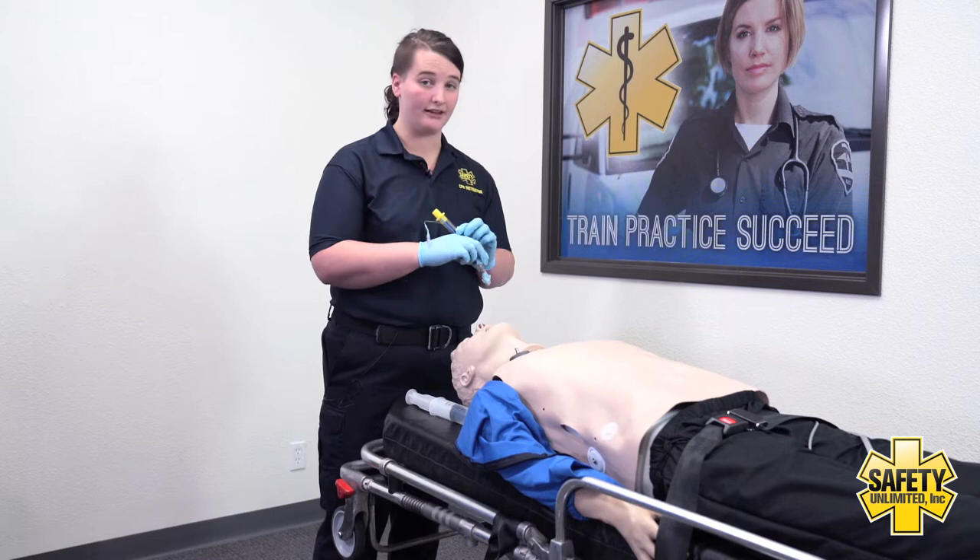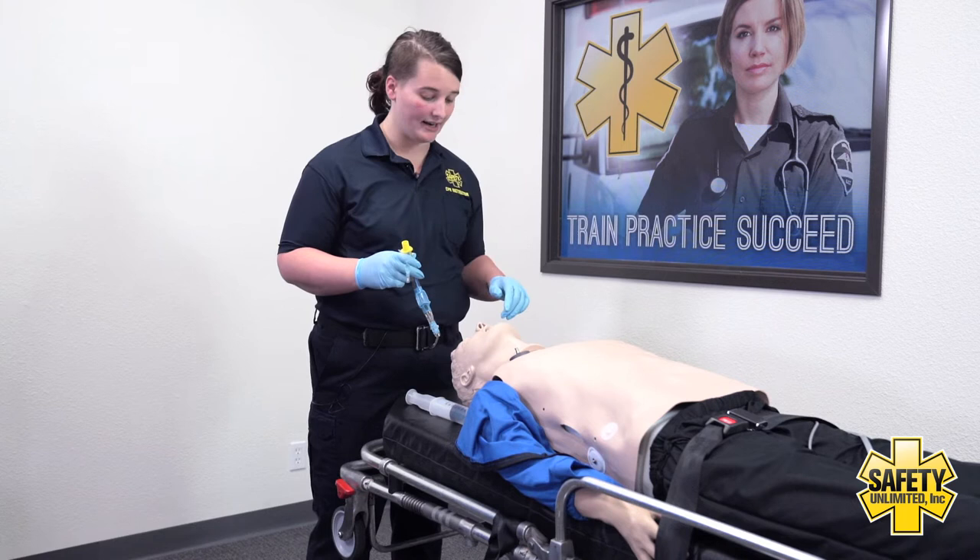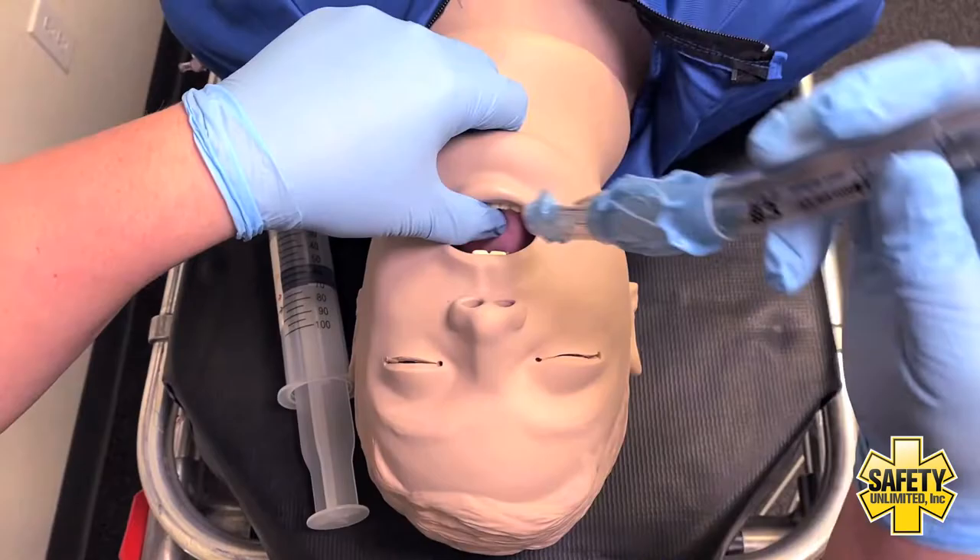I'd then lube the distal tip of the device. I'd instruct my partner to stop ventilating. This is a blind insertion.